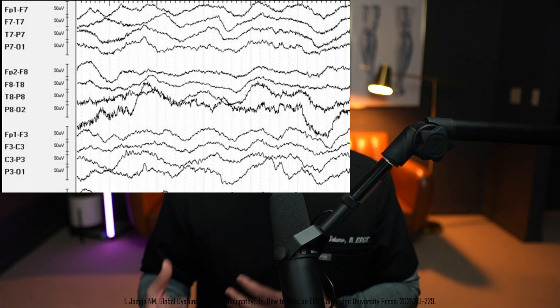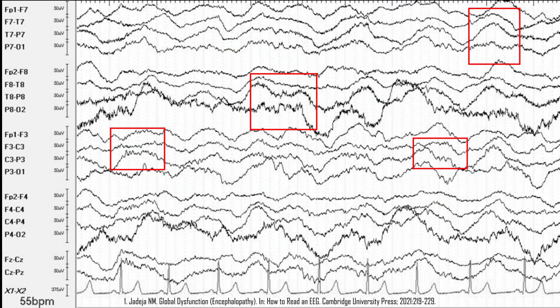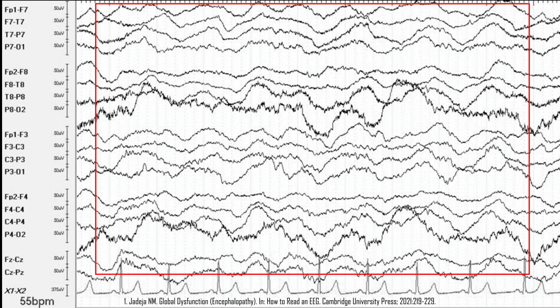Continuous generalized slowing, or CGS, is observed on an EEG as polymorphic delta activity. This activity is continuous or nearly continuous, covering more than 80% of the recording, and crucially, it's unreactive.